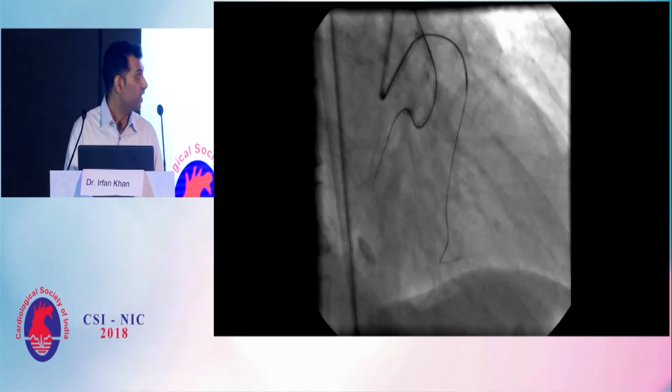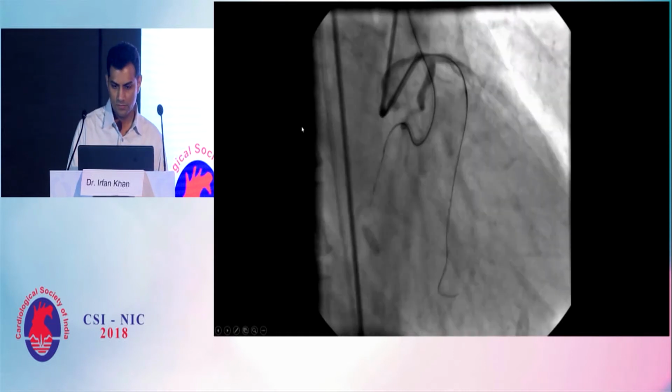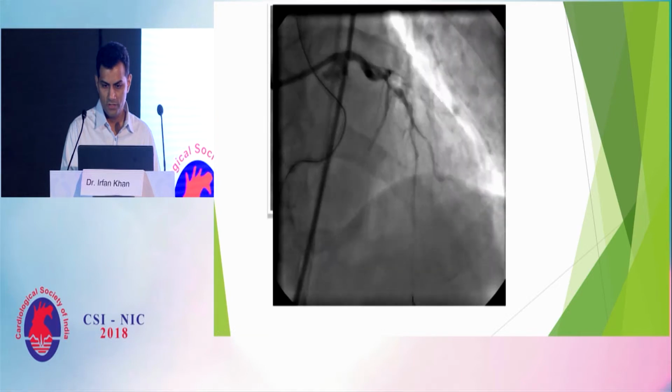As we tried to cross the RCA CTO, the patient became hypotensive. ST became elevated globally. What we did was we overlooked the LAD. The LAD had to be treated first.